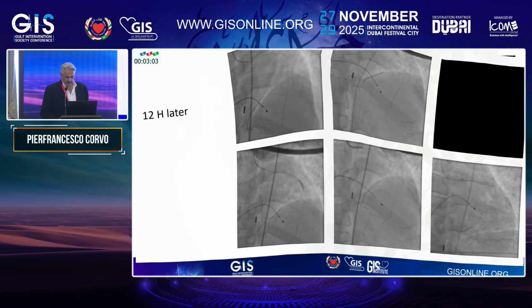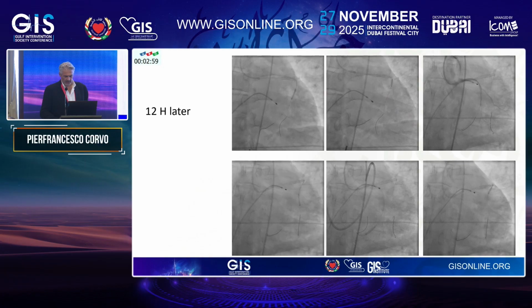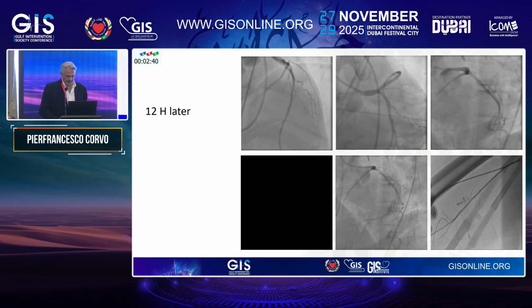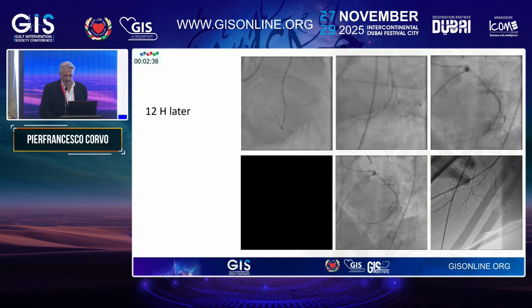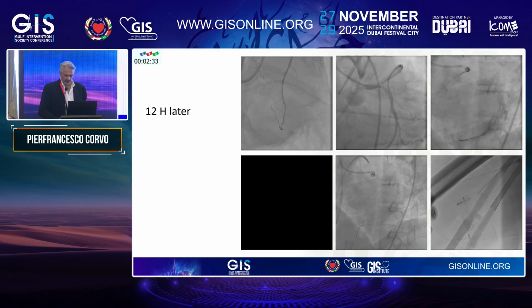But the patient didn't improve. So again, multiple dilatations. You see the aorta is not moving. The patient had a cardiac arrest. We decided to escalate. Firstly, with the bradycardia, we decided to escalate with the IABP, but the patient was not improving, and the CPR was still ongoing. The anesthesiologist was managing the ventilation. After multiple attempts, the flow in the LAD was restored.